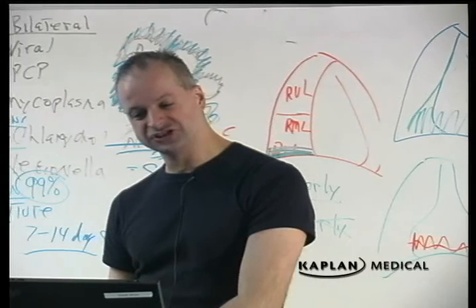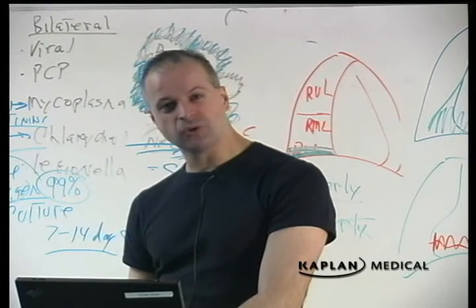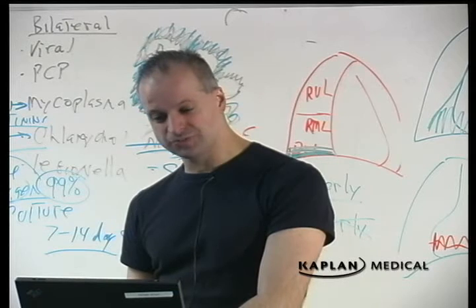This is inflammatory bowel disease. Crohn's disease in the small bowel, ulcerative colitis in the large bowel.